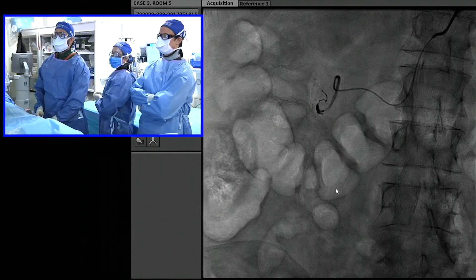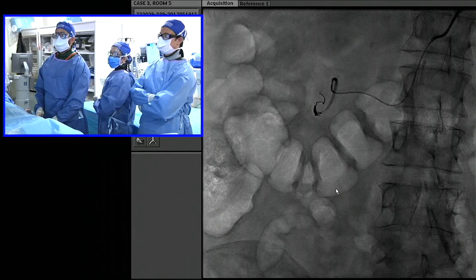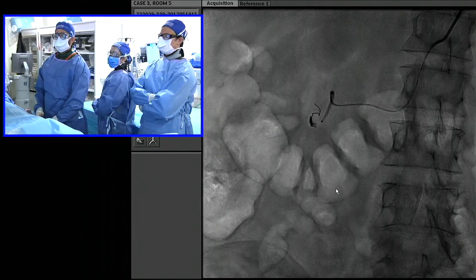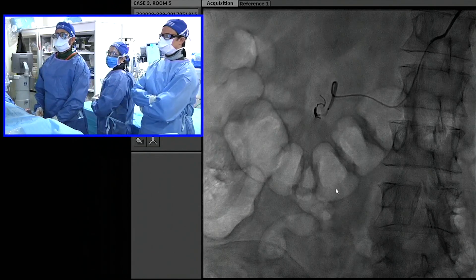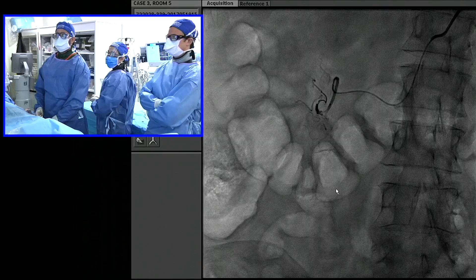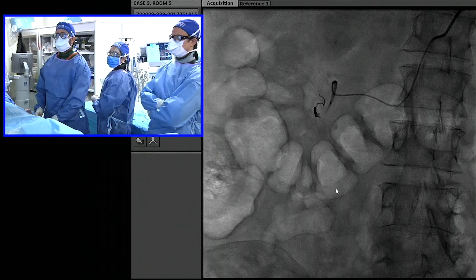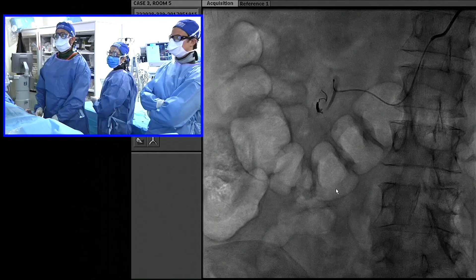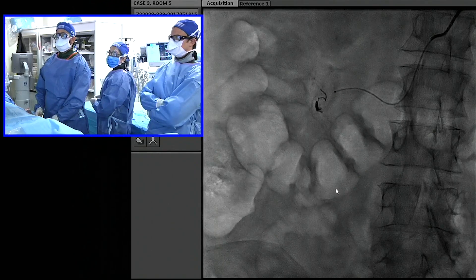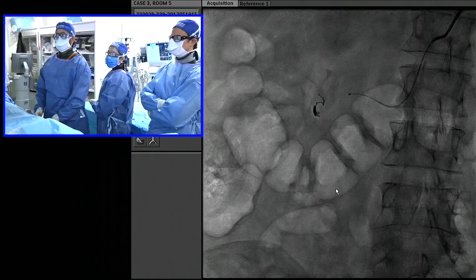We're injecting right on top of the coil pack. I don't really want to force the issue here too much. As you can see, we already got a little spasm in our vessel here. I'm going to back it out all the way.